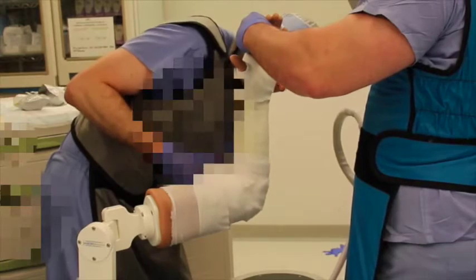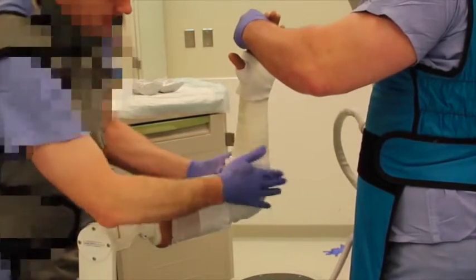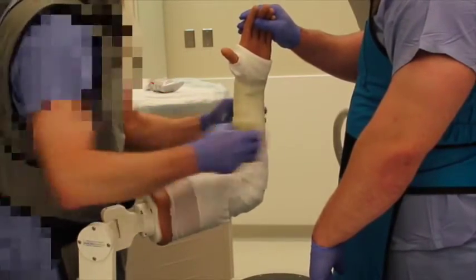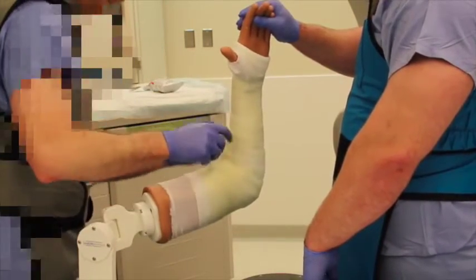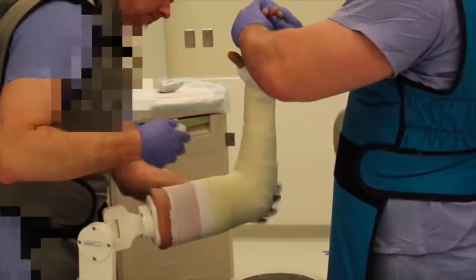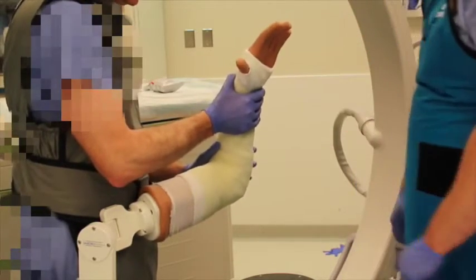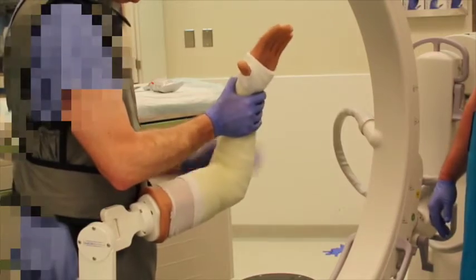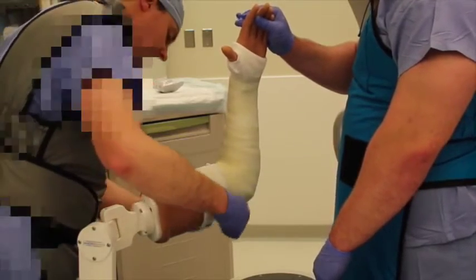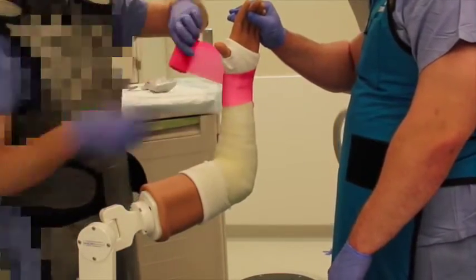This part of the cast should be well padded around all bony prominences. Care should be taken not to change the elbow flexion angle during application of this cast. After this, the stockinette is rolled down around the edges of the cast, and the final so-called Hollywood roll can be applied.